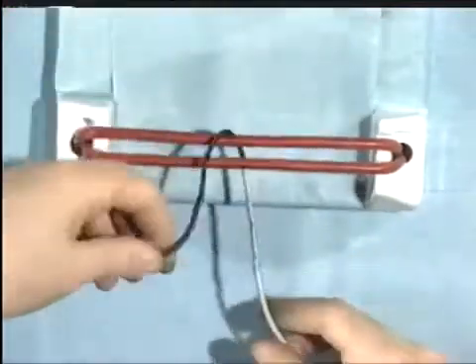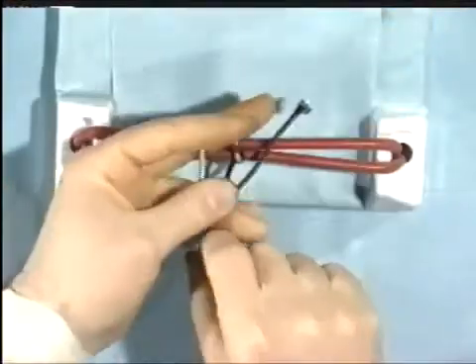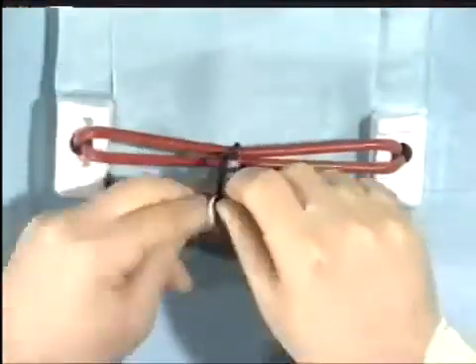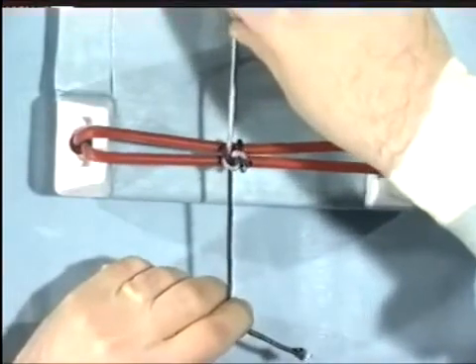Always remember to cross your hands as you see here. For added security, two reef knots may be tied on top of each other.